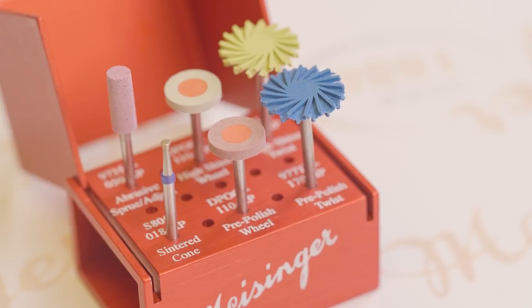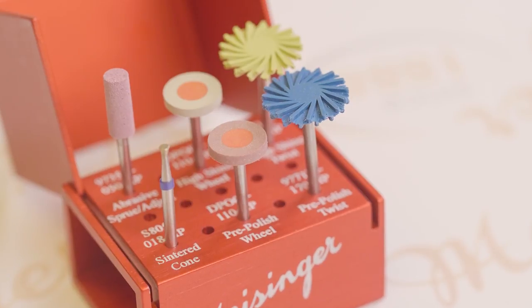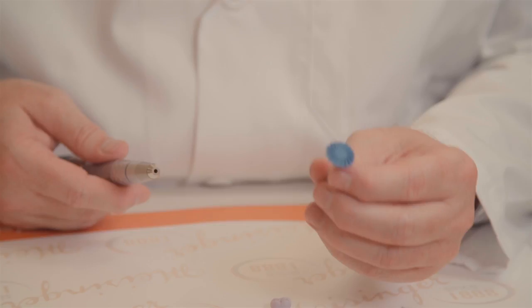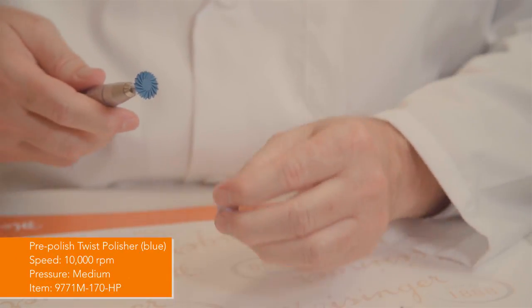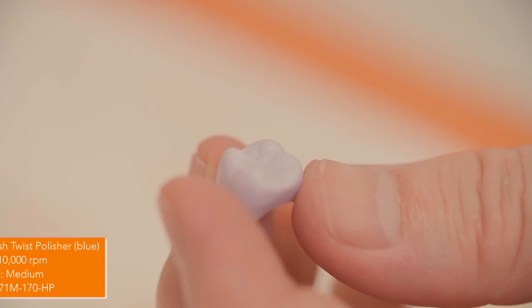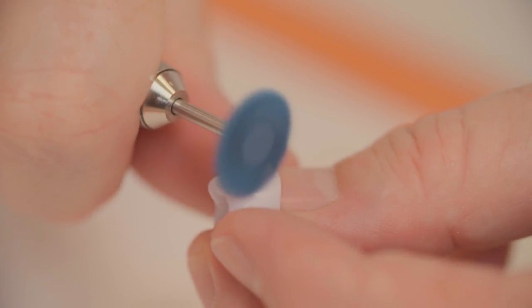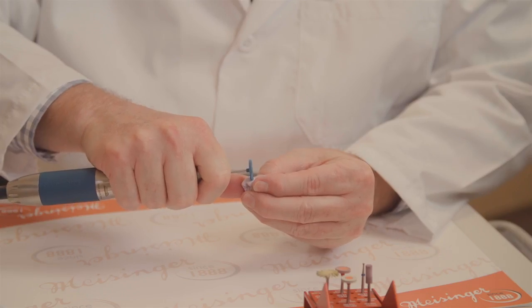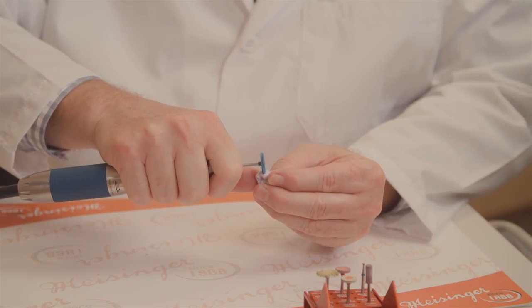Again, the high shine wheel, which is in the upper row in the middle, is used on anteriors to accentuate your line angles. So now we're going to get into our pre-polish twist wheel. This is blue in color. We're going to run this at 10,000 RPM. It really works well between 8 and 12,000. I like 10,000. And we're going to run it at medium pressure. We're going to let this work. Again, we're not going to use this on the mesial and distal contacts. We're only going to use the high shine twist on that.